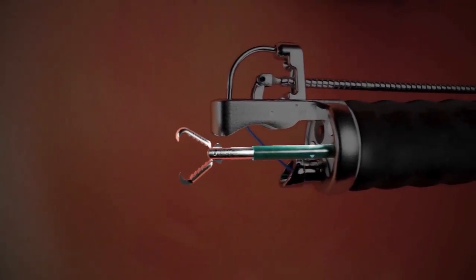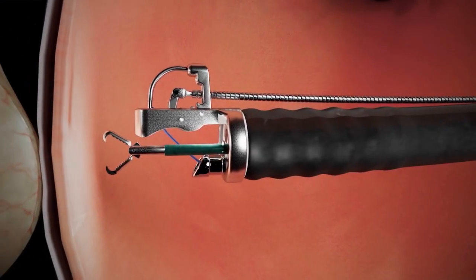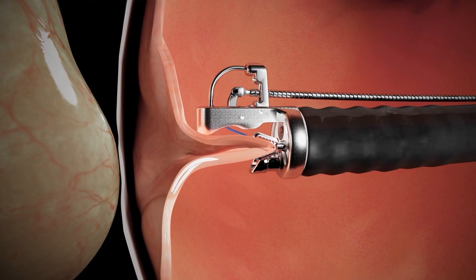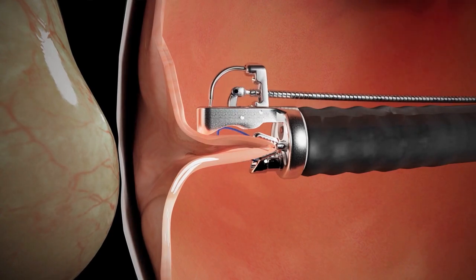A mixed-tooth grasper represents an alternative to the helix. The grasper, with its combined rat tooth and alligator tooth design, effectively secures gastric tissue without transmural penetration, reducing the likelihood of full-thickness injury and extragastric tissue involvement. As such, patients may experience less pain and decreased risk of adverse events.